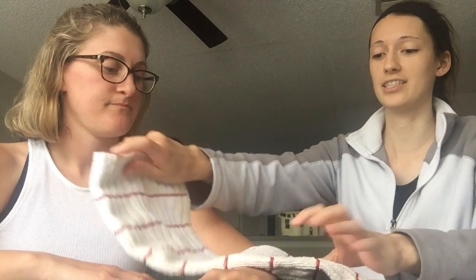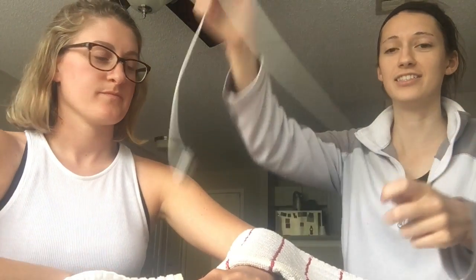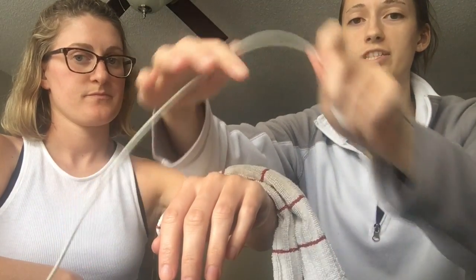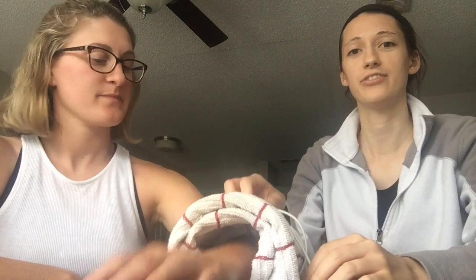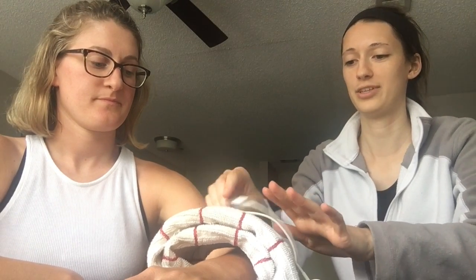So we're going to imagine here. I'm going to place this over her wound just for infection control. And then we're going to do the inductive coil diathermy, and I chose this one because her wound is deep, and so imagine this cord is the inductive coil. Her wound is deep, so the inductive coil is going to have effects deeper than the capacitor plates.